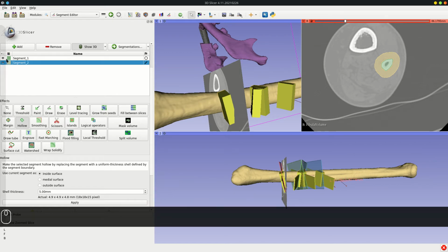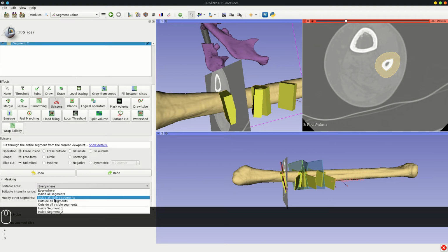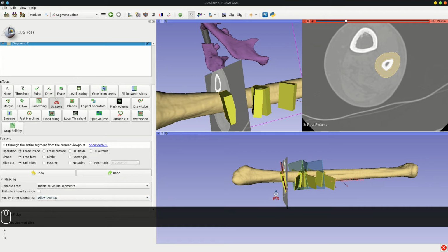Now it is a matter of editing this segment to the surgeon's preference, and I recommend to practice with the segment editor. In editing the fibula guide base, it is easier if the red slice is reformatted perpendicular to the fibula in the same way using the slice intersections.